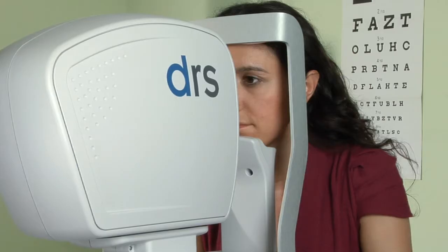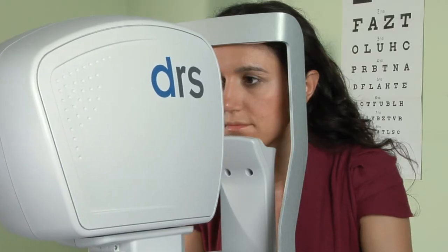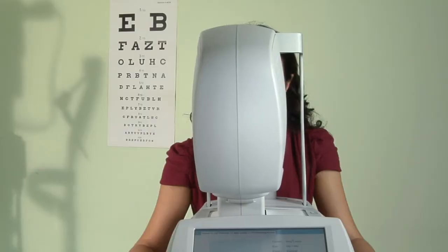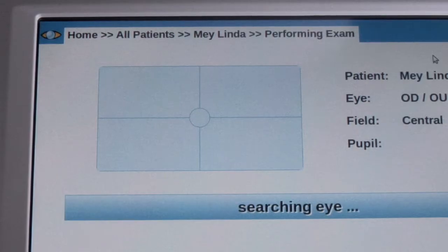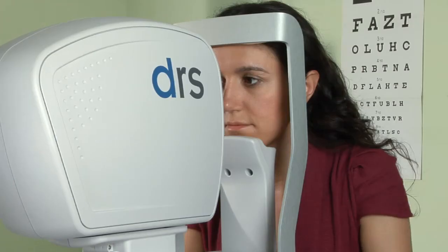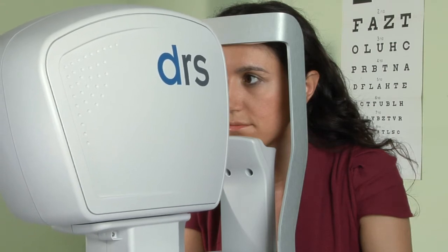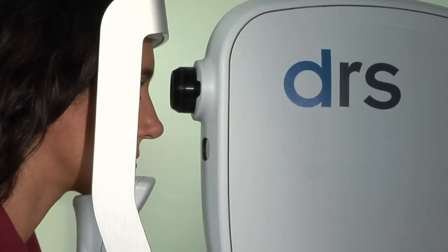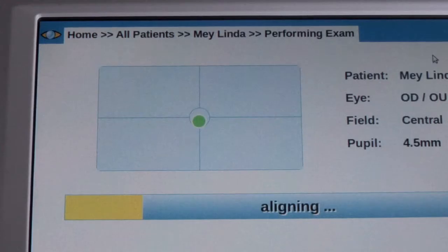From this point on, the process is completely automated. No operator is required as the DRS self-aligns to the eye under exam, automatically focuses, and captures the image.